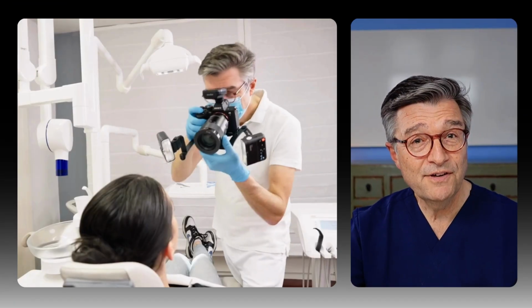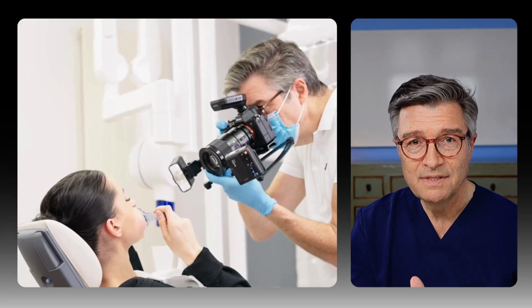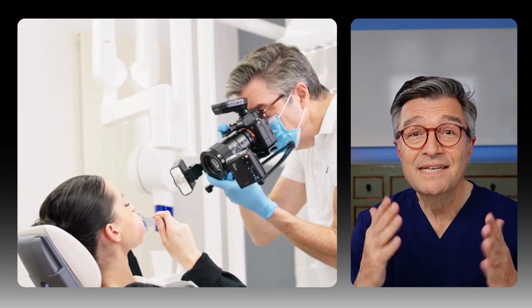However, it's not enough. Clinical photography. Now we look at the patient using high-quality extraoral and intraoral photographs. Extraoral portraits and smiles help us assess facial aesthetics, lip dynamics, and symmetry. Intraoral images with mirrors and retractors show us teeth alignment, soft tissue condition, occlusion, and more. These images become part of your documentation, communication, and planning workflow.